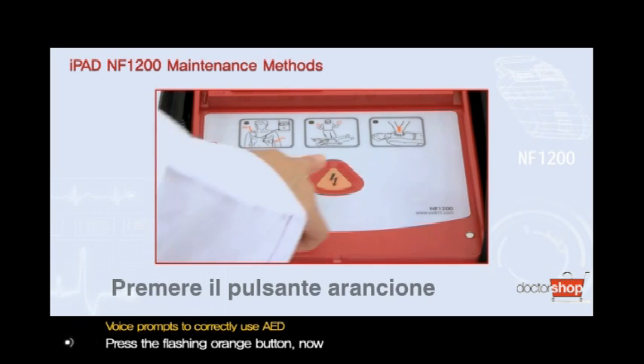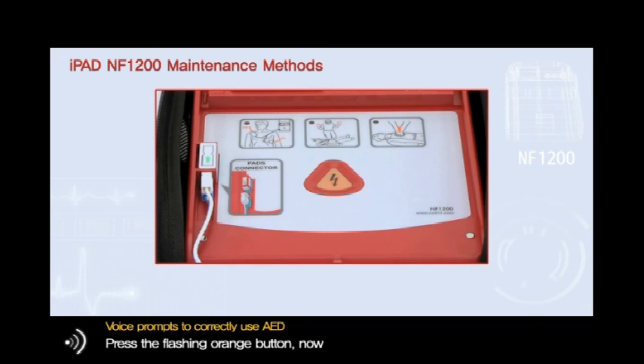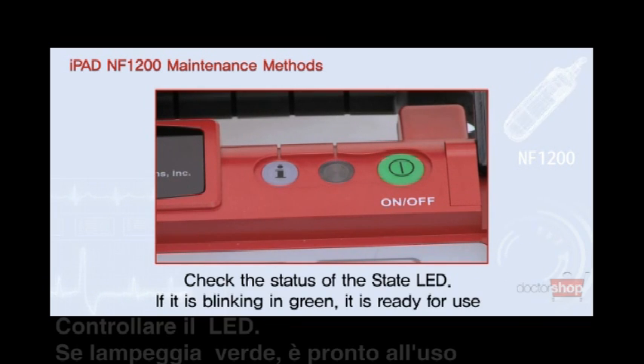Press the flashing orange button now. Press the flashing blue eye button. Check the status of the state LED.